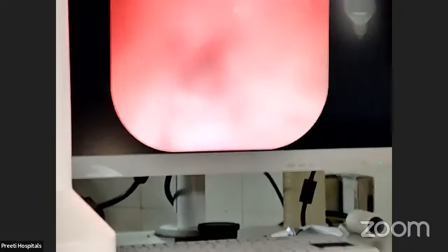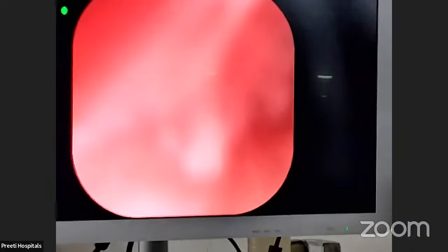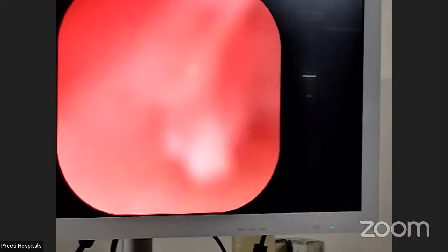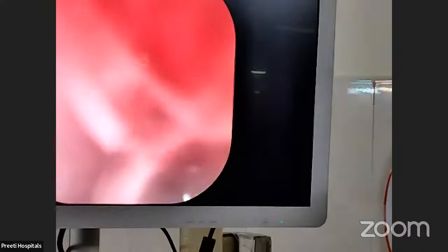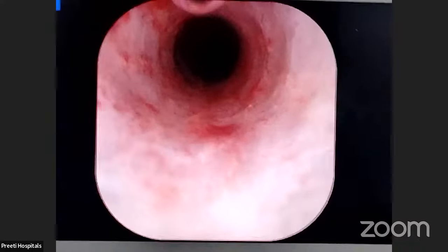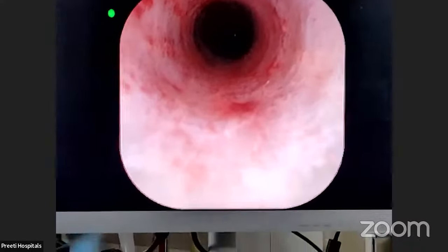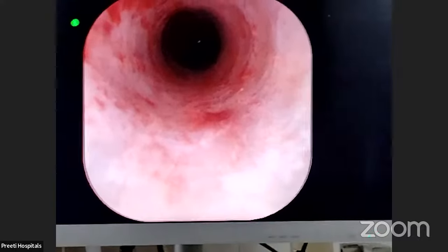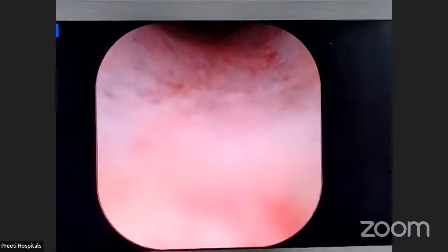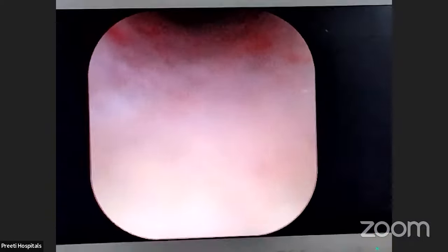Okay, now take out this, put the water. First we will see the ureter and then decide. If it is not going, then we have to use the access sheath, it's small. Now see, this is the ureter, you can see. Leave it and come back, flush, flush, yeah. Now you stay here, hold it, come back, hold tightly.